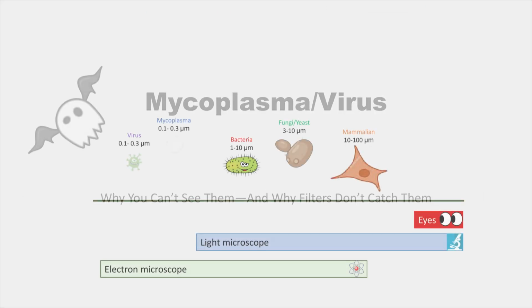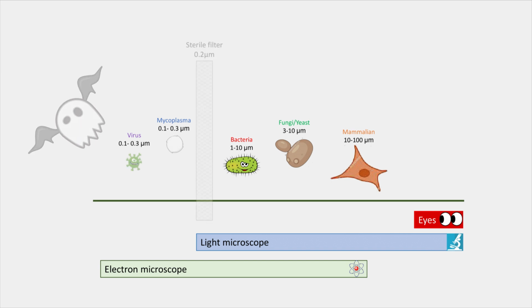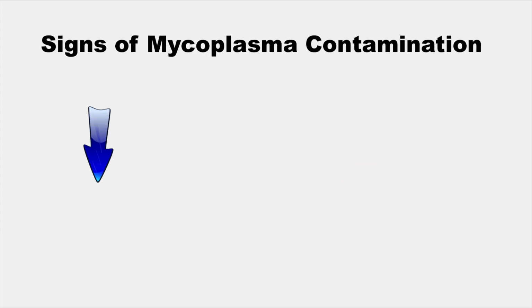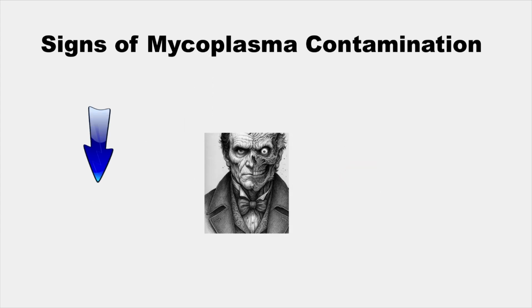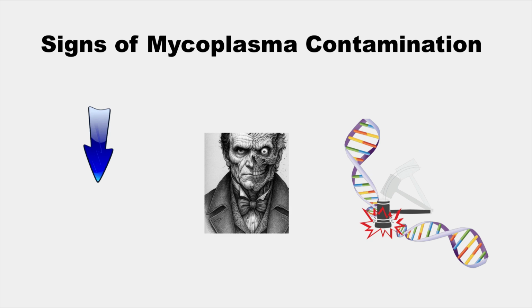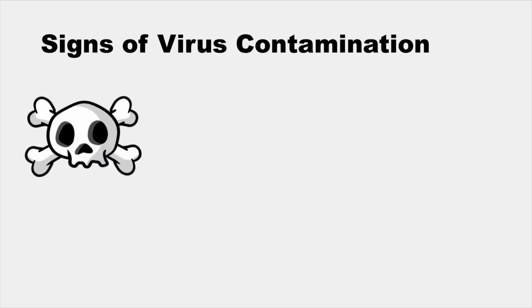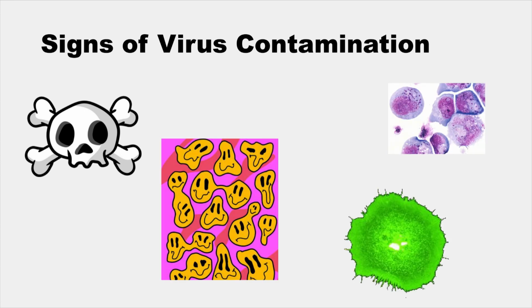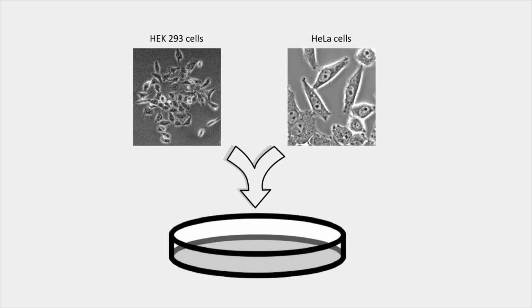Mycoplasma and viruses are invisible under the microscope, and they slip past standard filters, but they leave clues. Mycoplasma contamination shows slow growth, altered morphology, and disrupted gene expression, while viral contamination triggers cell death, abnormal cell shapes, inclusion bodies, and syncytia. Cross-contamination, not much to say. It's pretty obvious. You see multiple cell types sharing the same plate.